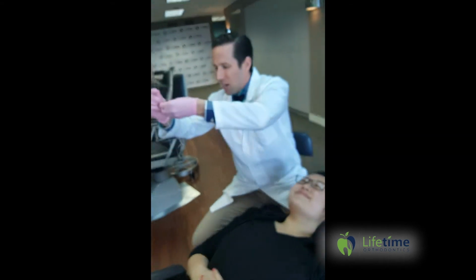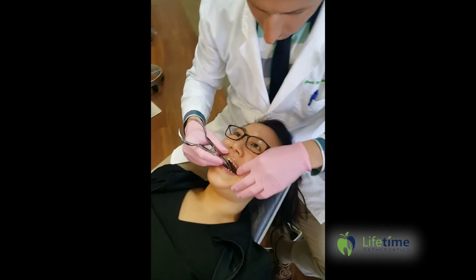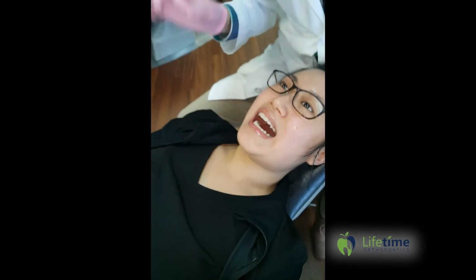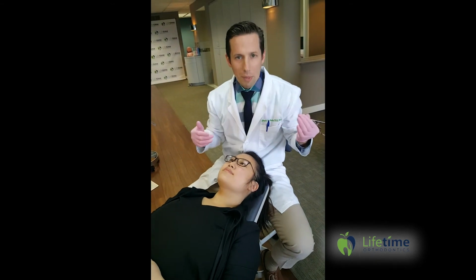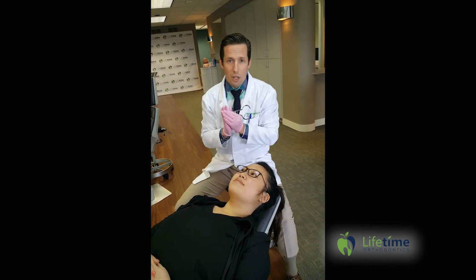If you ever need to take it out, we have scalers. I don't encourage you to take it out, but you can get a toothpick or a scaler and get it in there and pop those out if you need to. Again, no need for you to ever have to pop those out, but this is how you can put them back in to save yourself a trip into the orthodontist. If you have any other questions, please reach out. We'd be happy to answer anything we can.